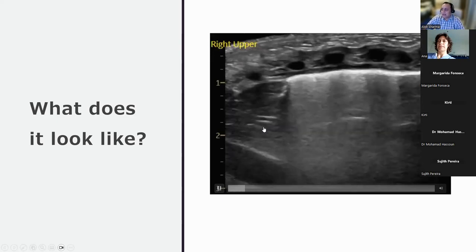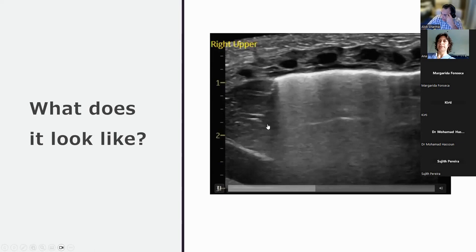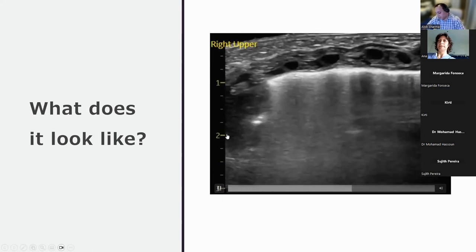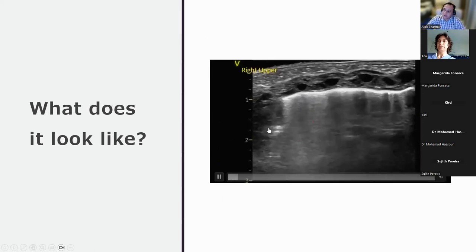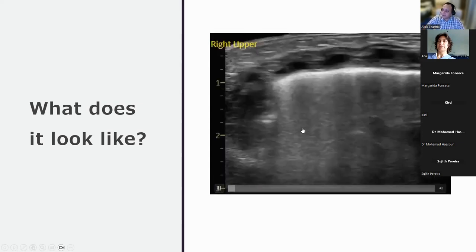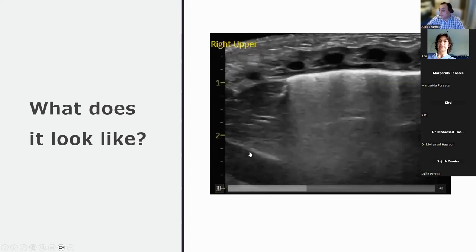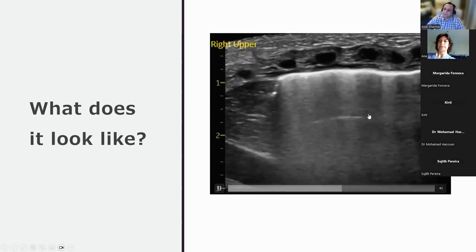Okay. This is actually technically the same baby. My apologies, I've just magnified the image. What I've done is take the last image that I picked up and try to focus in on this zone. So can you see how sickle-shaped, kind of triangular it looks?